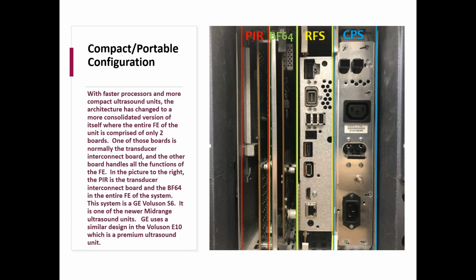This system's a GE Voluson S6. It's one of the newer mid-range ultrasound units that GE offers, but they also use a similar design in the front end of the Voluson E10, which is a premium ultrasound.